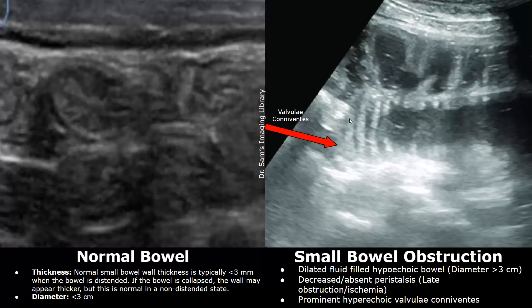Another feature often seen in small bowel obstruction is the hyperechoic prominent appearance of the valvulae conniventes — the intestinal folds. These intestinal folds appear hyperechoic and more prominent in small bowel obstruction; normally they are not very clearly seen.